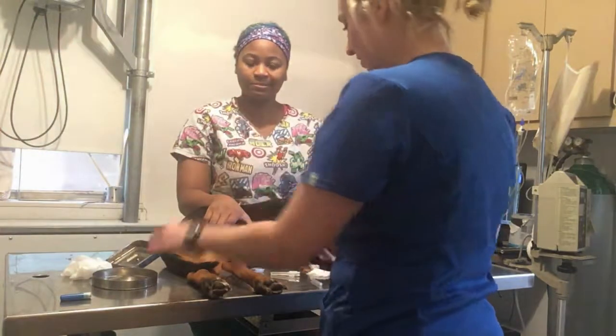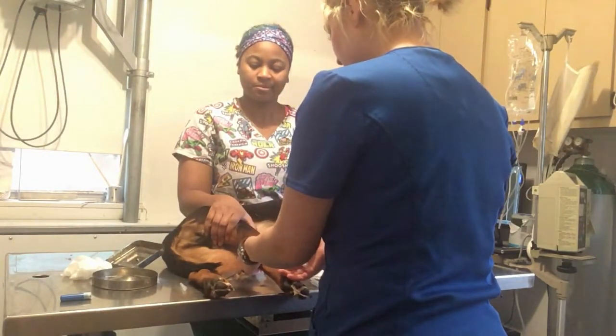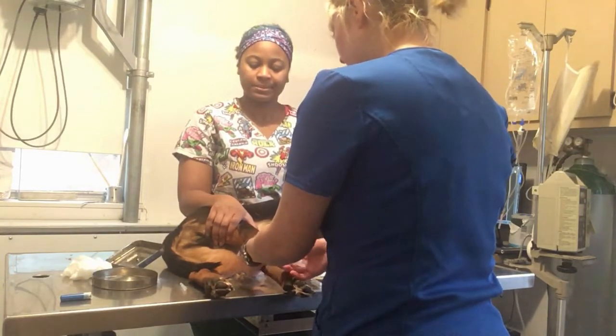Actually, the last step is going to be you're going to flush the catheter. Make sure that you can feel it through the vein.